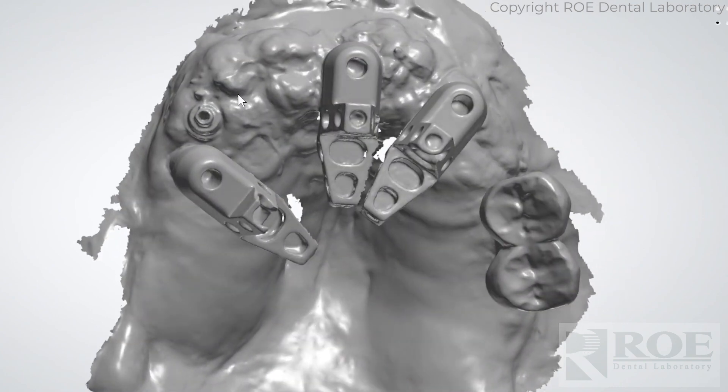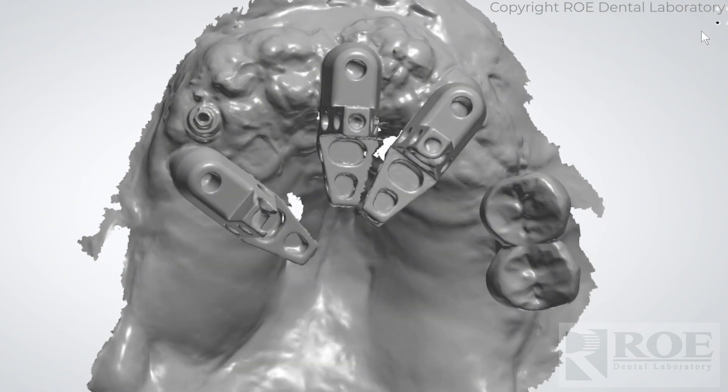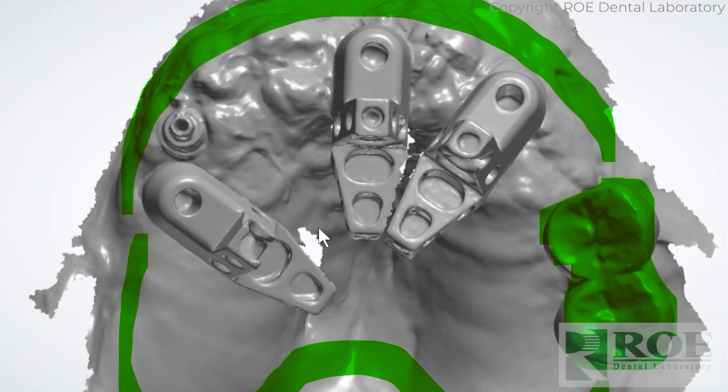Because he scanned a lot of the land area — the tissue and everything — we were able to use all the land areas to preserve and restore the bite. So we used these two teeth here, used tissue in the land areas, and put the bite back together.